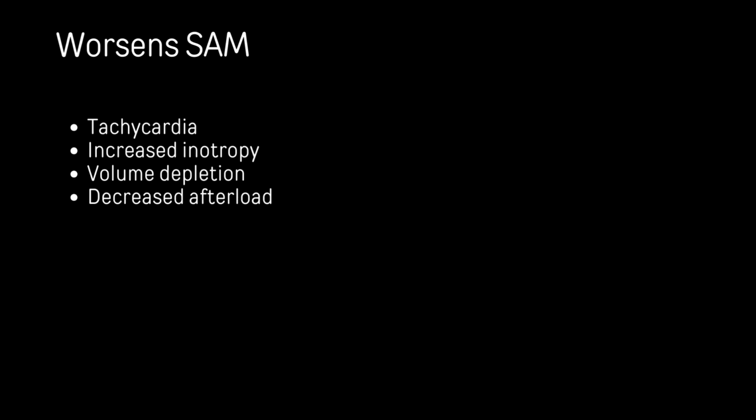So it can be just a septic patient. They're going to have probably a bit of hypertrophy. It's not going to be a completely normal heart. And it's usually in the context of a hyperdynamic heart. So patients are really, really tachycardic, so that the mitral valve flaps up and it's never been masked. The sepsis will unmask it. So then it flaps up and then you get that left ventricular outflow tract obstruction.